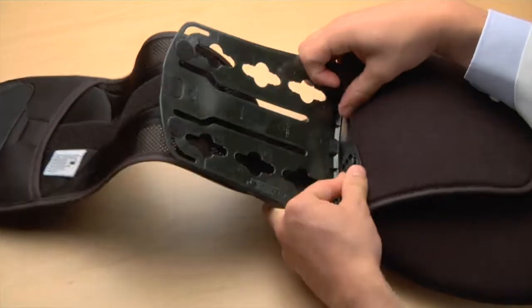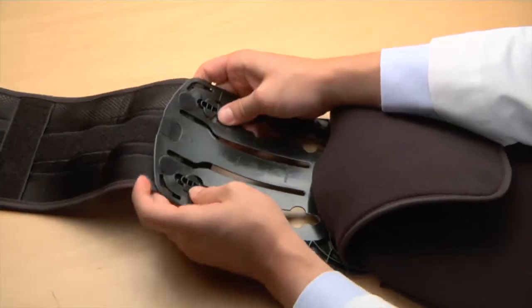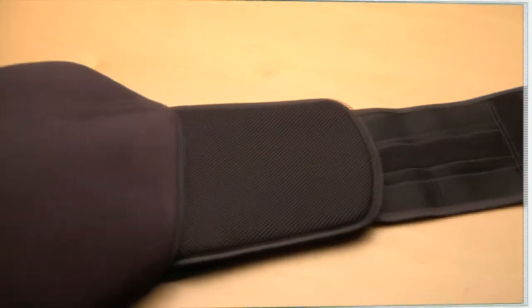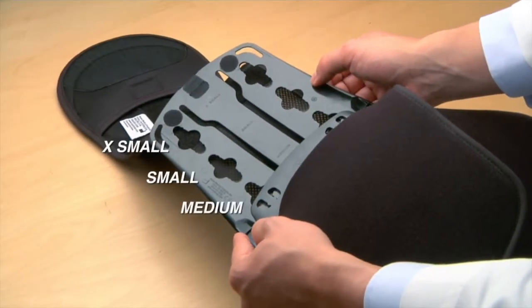For large, extra large, or double XL sizes, pull the belt out through the sizing adjustment slot and position the male rivets in the appropriate sure slot openings. Adjust both sides of the brace equally.